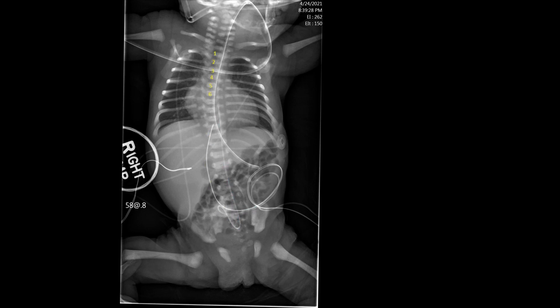Now let's look at where the umbilical arterial catheter should terminate. I have labeled the upper thoracic vertebral bodies for your convenience, one through six. We want the tip of our catheter terminating between T6 and T10. So why is that? Let's think about the aorta positioned just to the left of midline and then the aortic arch in the chest.